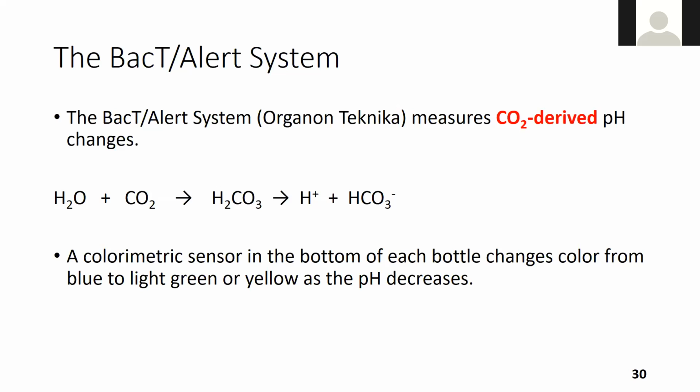We gram stain the blood out of the blood culture bottle. See what we have. Is it gram positive cocci? Is it gram negative rod? What is growing in the blood culture bottle? And then we set it up. We streak it out on blood, MacConkey, chocolate, anaerobe. Both of these bottles are designed for aerobic and anaerobic growth, but most of the time it's an aerobic growth and it's growing in both bottles. And that's weird too, because one bottle will turn positive, and then the other usually turns positive not long after. So you're sitting there working with one and the machine goes off again.